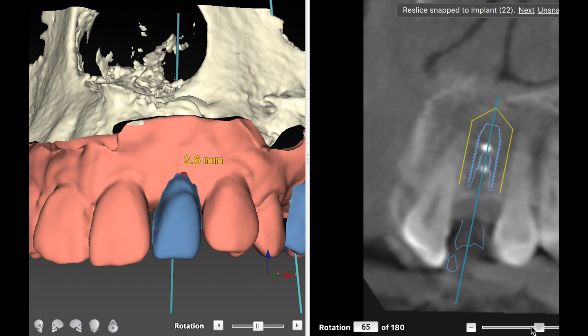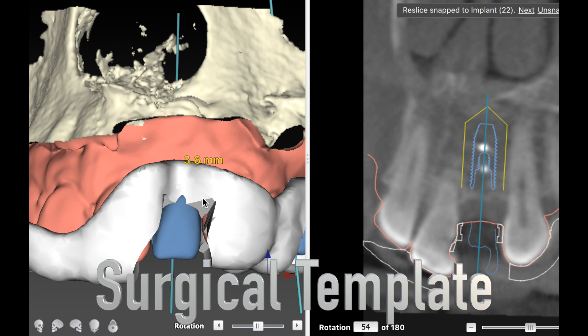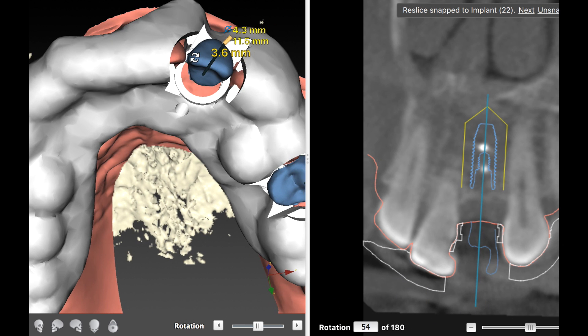The surgical template is going to give us depth and angulation for the placement of this implant. We click a button and then the surgical template is fabricated. What this surgical template will have is a little ring, and the ring will guide you to the correct depth and angulation. It's so important to have this in the exact position for depth, emergence profile, and proper angulation.